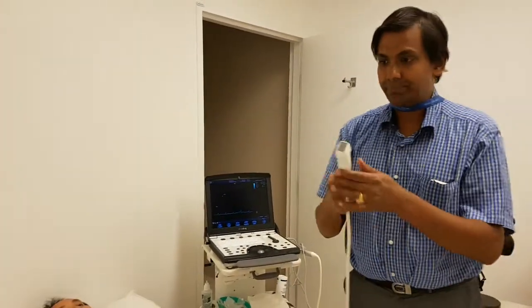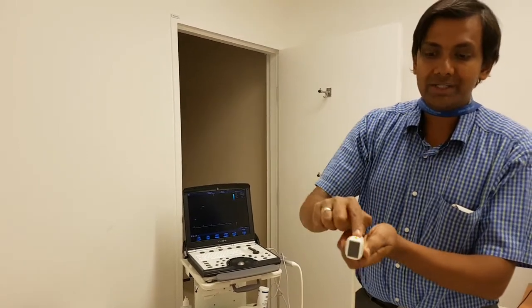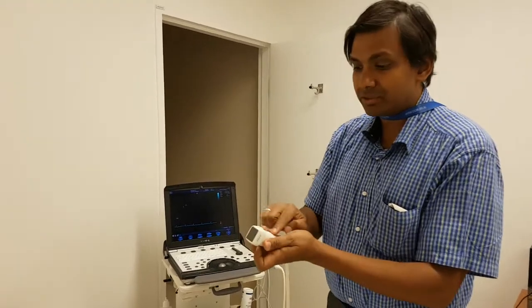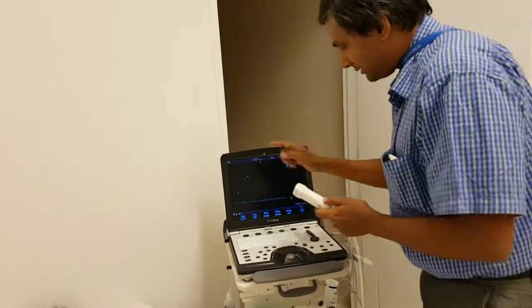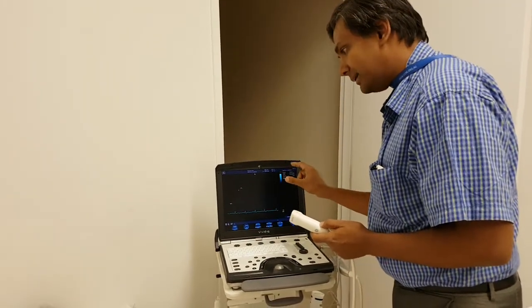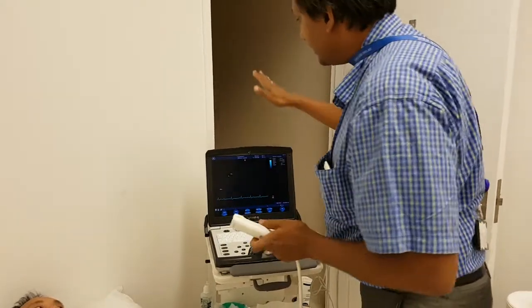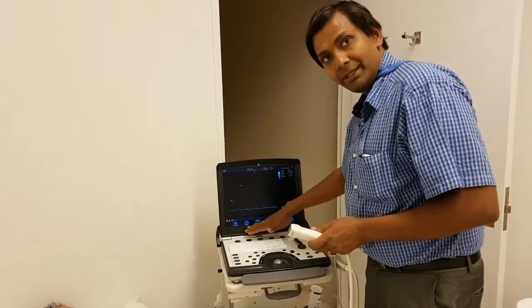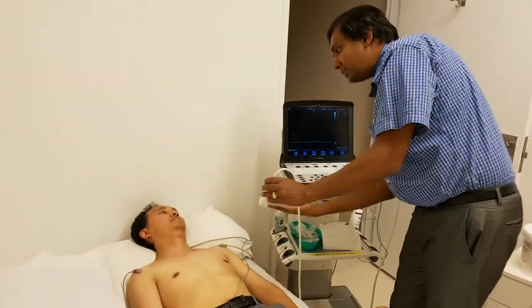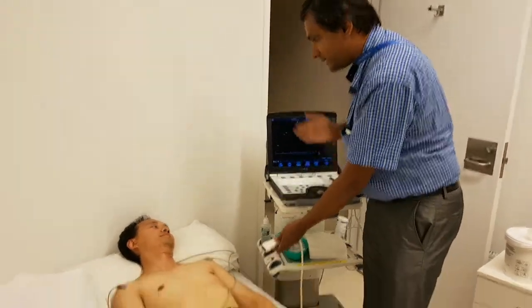The next thing is understanding the probe. In every machine, the probe has two sides. One is where the probe marker is — on the GE machine it comes with a light as well, while on many other machines there's just a groove. This is important because the probe marker corresponds to one side of the screen — the screen marker — and the screen marker is always on the same side as the probe marker. The top of the screen is always superficial and the bottom is always deep. So if you place the probe from anterior to posterior, superficial will be anterior and deep will be posterior. The other side I just call the anti-probe marker side.